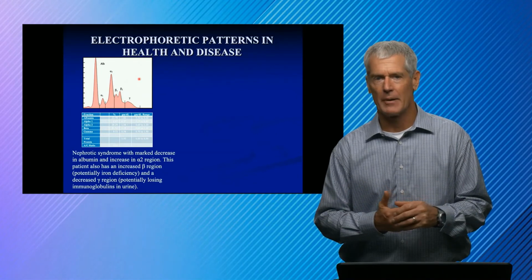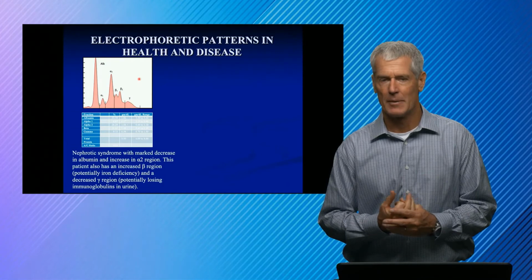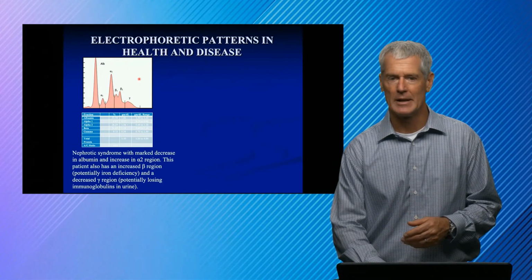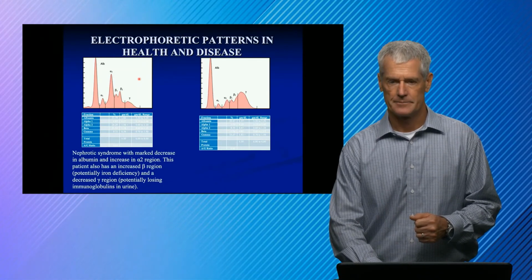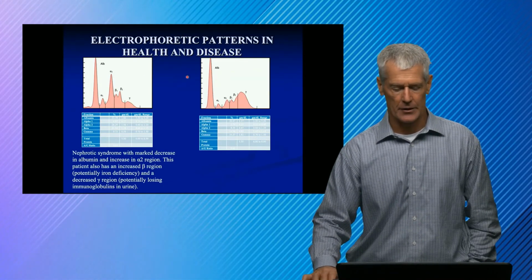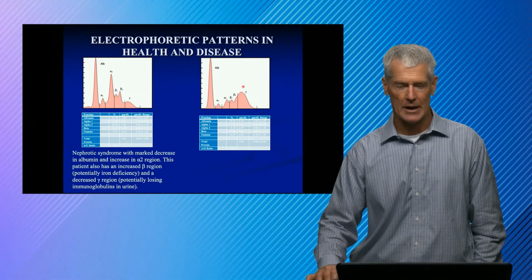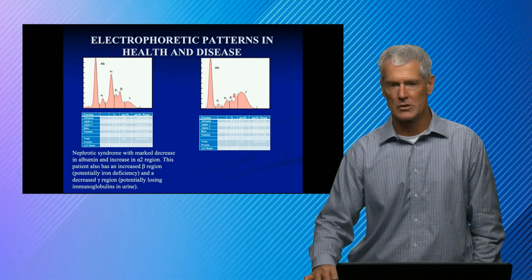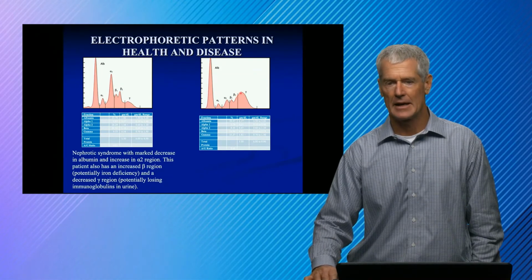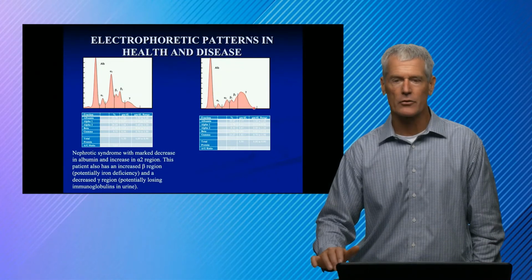You might have picked that up by looking at the patient by doing a basic metabolic panel where you saw hypoalbuminemia, and then if you followed it up, you would find this pattern. This pattern is an example, again, of a polyclonal hypergammaglobulinemia, and this is a specific kind because we don't see a decrease between the beta region and the gamma region. We call this beta-gamma bridging, and that happens in alcoholic cirrhosis.